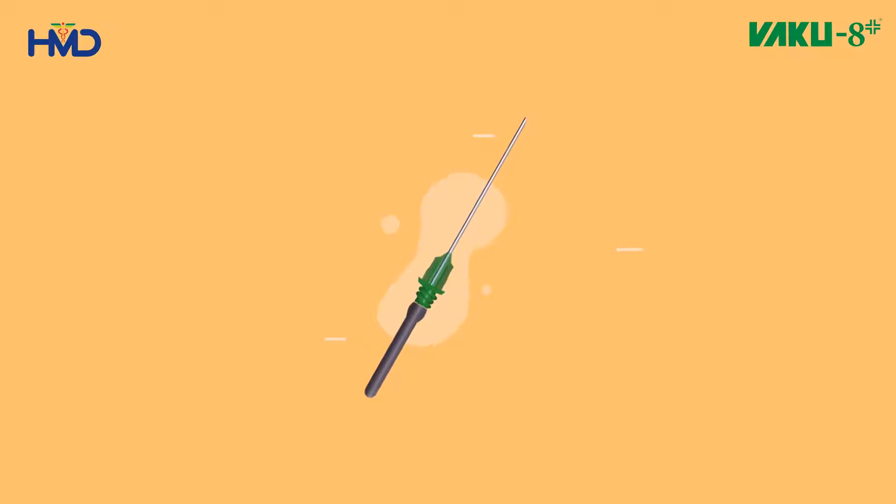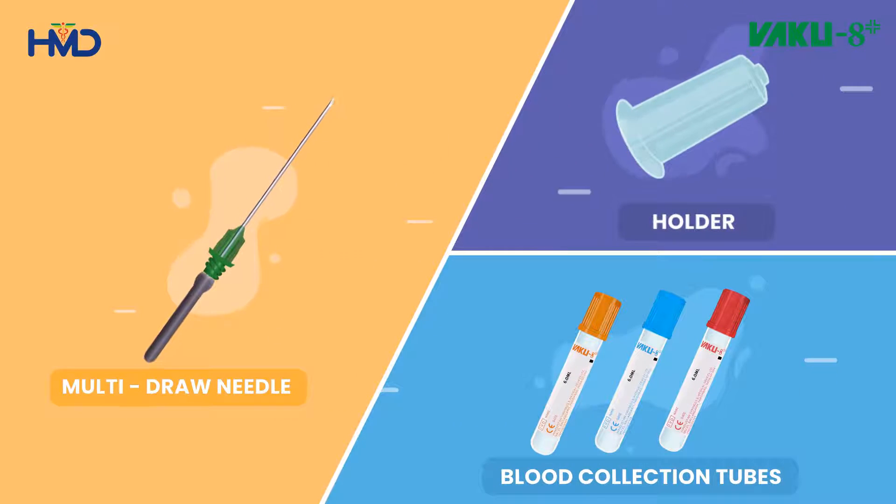VACU-8 blood collection system consists of a multi-draw needle, a holder, and blood collection tubes.